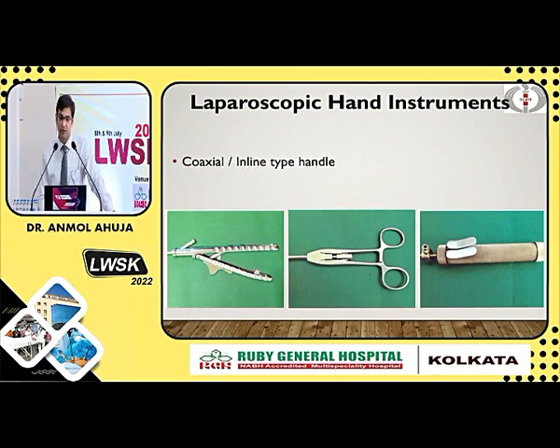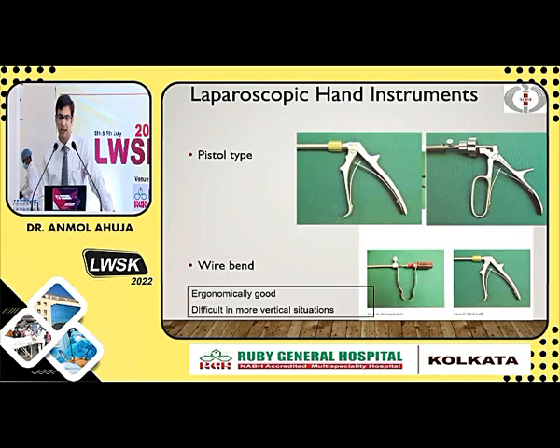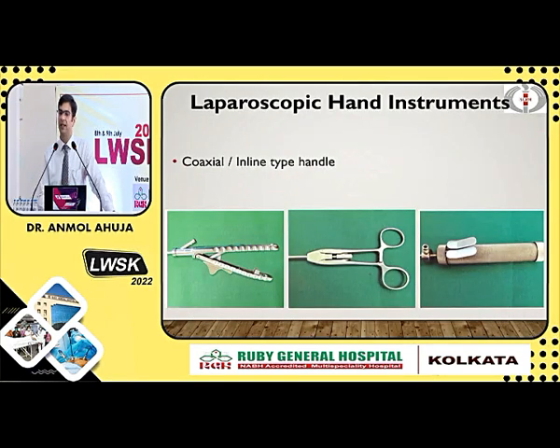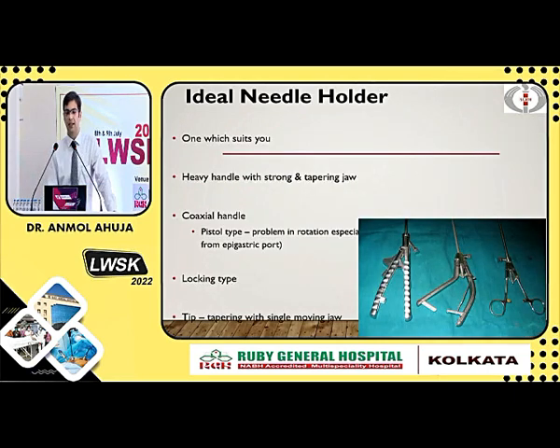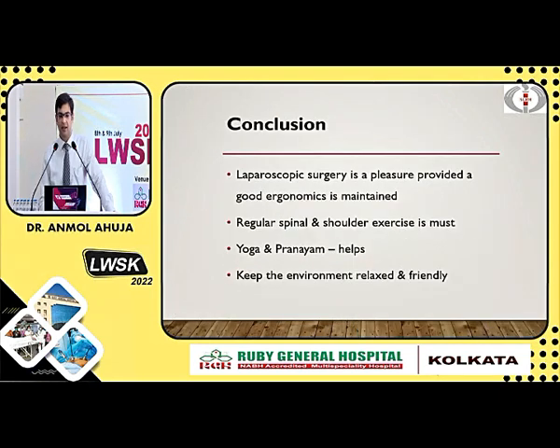Then comes the instrument which I love the most, the needle holder. It has different types of grips, depending on which type of grip you find comfortable. For me, I am very comfortable with the inline type handles. And these are the pistol type grips. Similar kinds of needle holders are also available. So these are the 3 types of grips in the needle holder. This is the coaxial grip, this is the pistol grip, and these are the ring type. Ring type is rarely used now. So basically this is the basics about ergonomics.